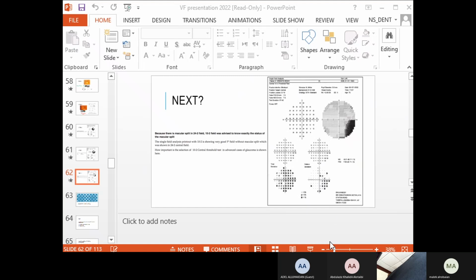And if you lose the patient, and the patient or his family complain, you may lose your license. This is not a game, okay? So always look at both sides. And if you have small temporal changes, think about neuro causes, because it is respecting the vertical midline, not the horizontal one. Okay, sorry. Yes.